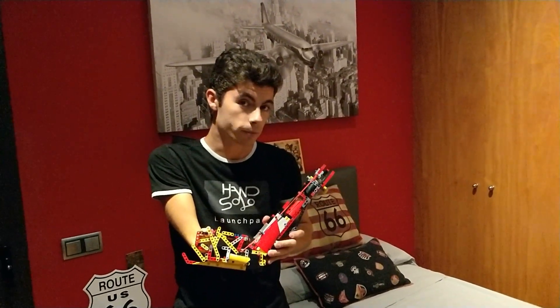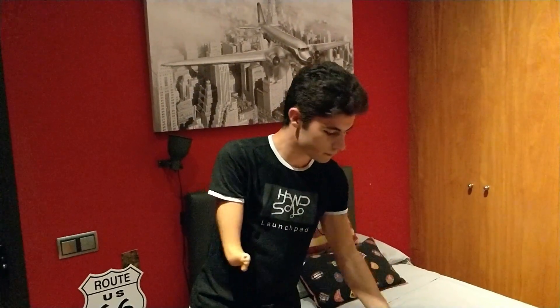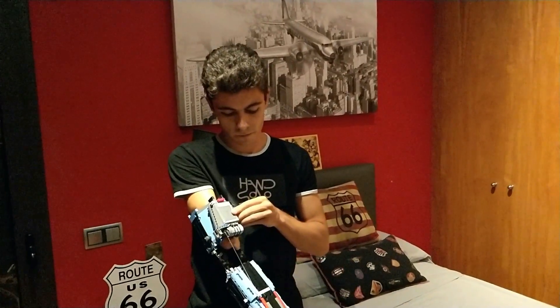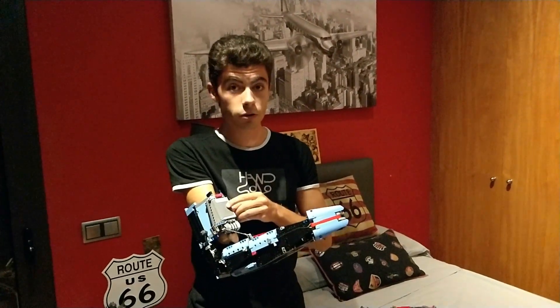This comes from a helicopter. The second prosthetic comes from a plane. It works with a motor.